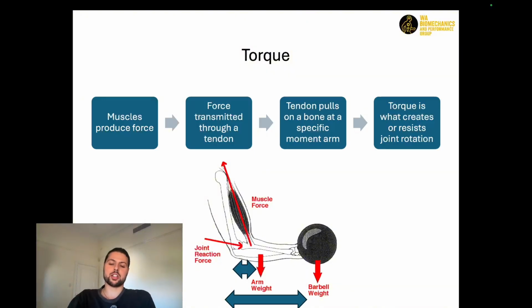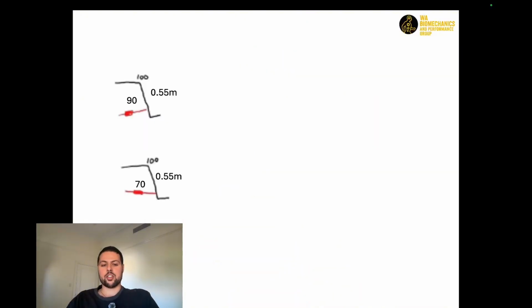So it could be creating that rotation to curl that dumbbell, or it could just be resisting the weight of that dumbbell and holding it there isometrically. And then this is taken straight out of Scott Morrison's Physiopraxis site, but it really sends the message quite well.